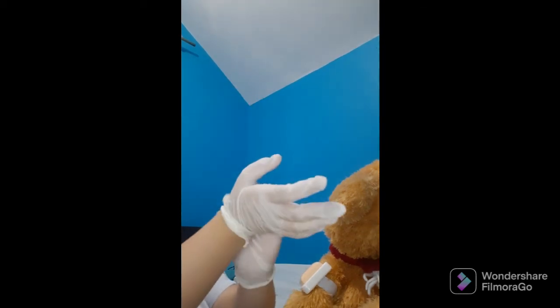And then, if meron pong bleeding na nag-occur, so pwede po tayo mag-apply ng pressure doon sa site with the dry sterile gauze until mag-stop na yung ating bleeding. After that, after injecting, we need to dispose yung ating mga supplies appropriately. So, we remove our gloves and discard. And we need to perform hand hygiene. And we document all the relevant information, such as i-document po natin yung medication given, yung dosage, yung time, yung route, and also yung ating assessment. And that's all for my written demonstration.